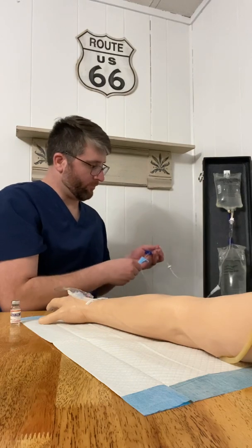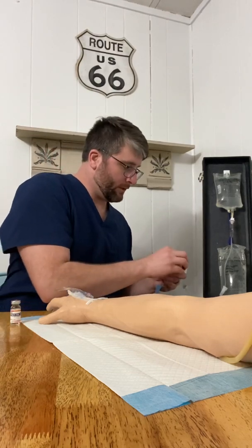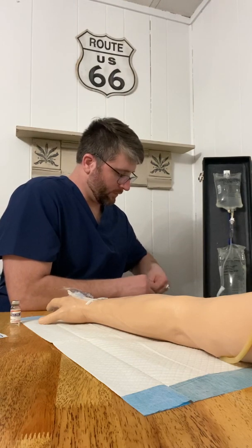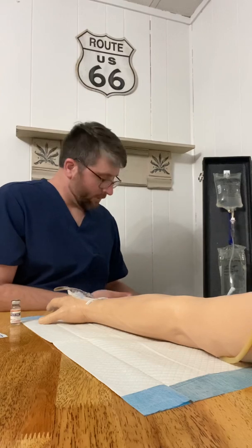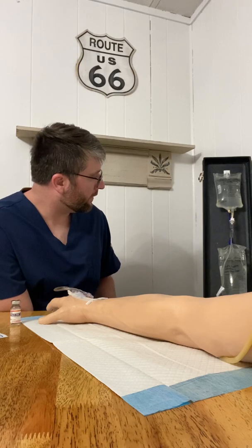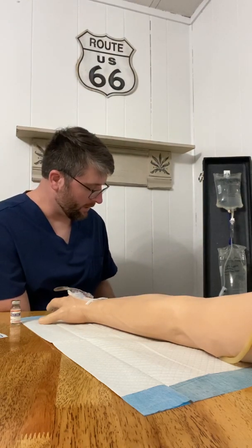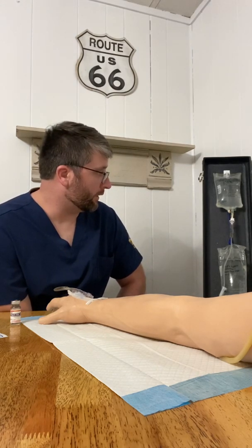Maintain aseptic technique. We're going to stop our previous one. We're going to take our alcohol swab and disinfect both our ports there. And then hook that up to the port just above our roller clamp, and then we're going to set our infusion rate. There we are. Open that up. We got that open, and we're going to give it as prescribed. We're going to give this 500 milliliters over 3 hours.